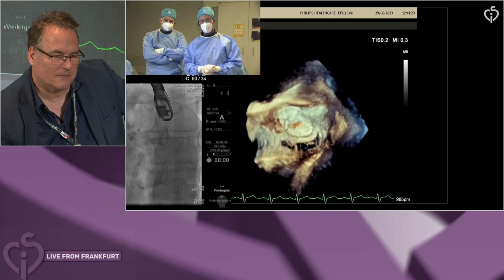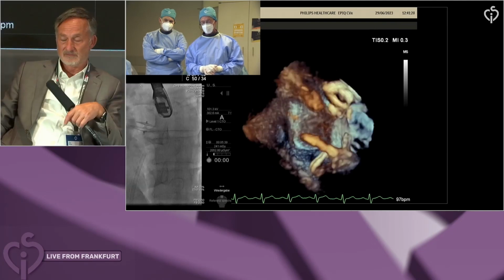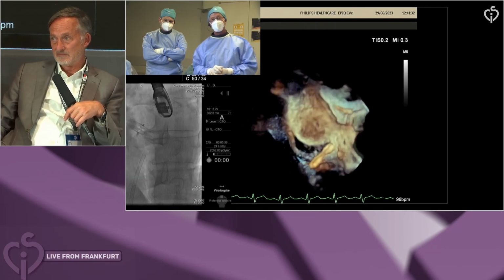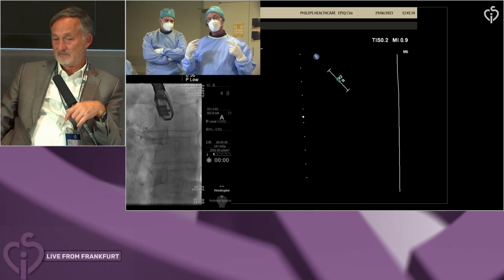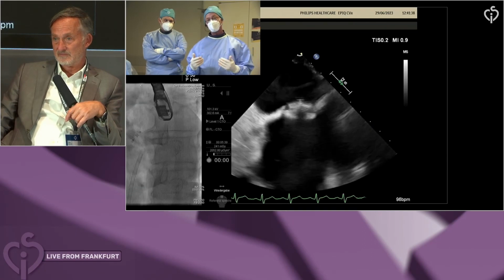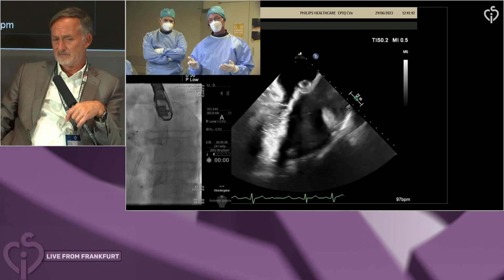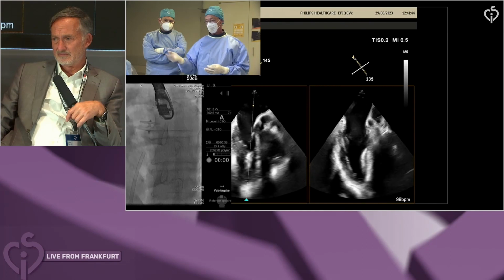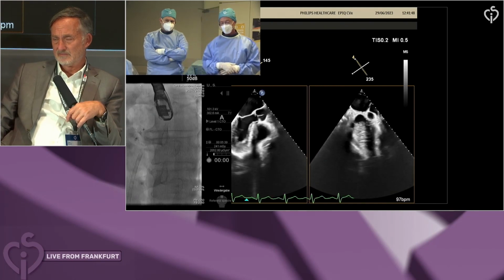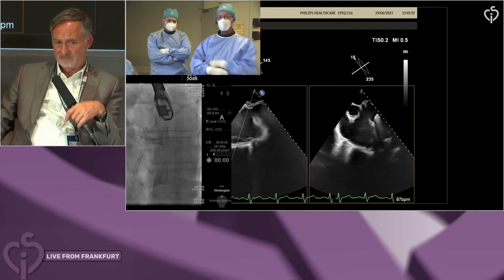So obviously, you do the pericardiocentesis, but the question is, what's next? Because if there's an erosion, the centesis will not cure the erosion, so you're going to intervene surgically, no? And what is the important part of pericardiocentesis? It's to retransfuse the blood, because this goes so fast that you cannot wait for blood transfusions. You have to retransfuse the blood immediately. And so it depends upon what to do then.